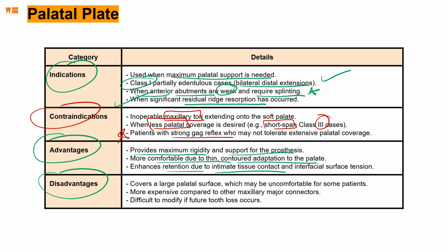Disadvantages are that they cover a very large area of the palate, right? It may be uncomfortable to some patients. More expensive because more material is used, right? Difficult to modify if the teeth are lost.